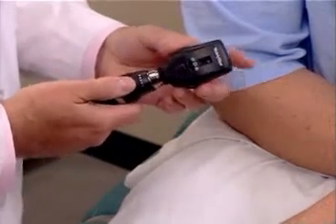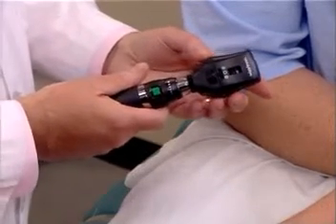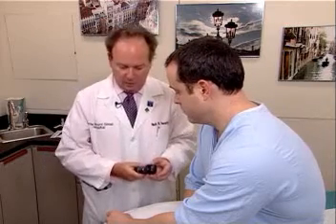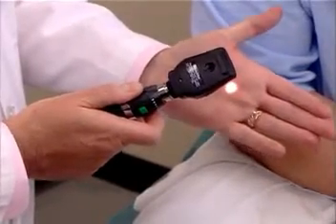In order to use this instrument, you want to use the instrument held in your right hand using your right eye to examine the patient's right eye. In order to do this, you should remove your glasses and have the patient remove his or her glasses as well. If the person is wearing contact lenses, or if you're wearing contact lenses, they may certainly be left on. The light should be placed on, as I'm demonstrating here, and the patient is asked to look in the distance.